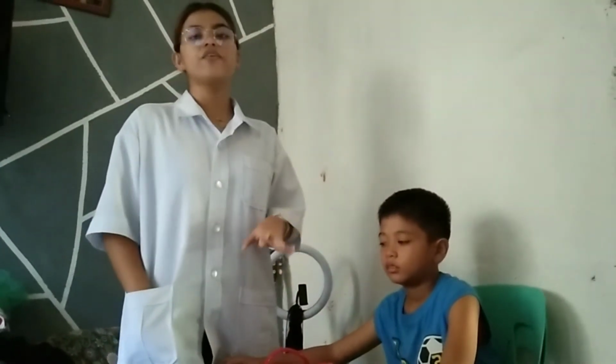So the blood pressure of the patient is 103/61, which is normal for our patients. After taking the blood pressure, we need to clean the earpiece of our stethoscope. After that, we need to document and record the patient's blood pressure for the client's chart.